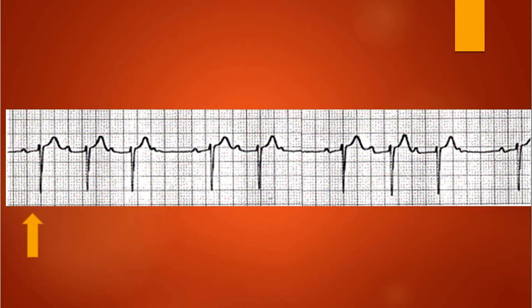So let's have a look at this one. As you can see, it will give you three complexes right at the beginning and then it's going to drop a complex. But look at what it does in between there — as you can see right here, you have a pretty long PR interval, and then you have another one.